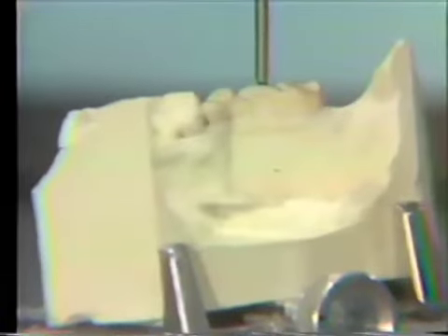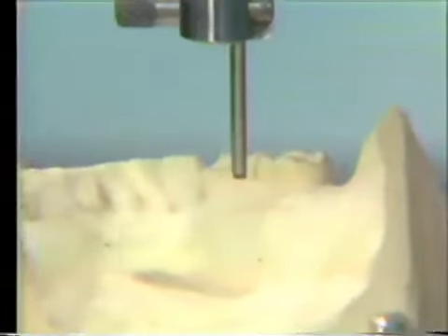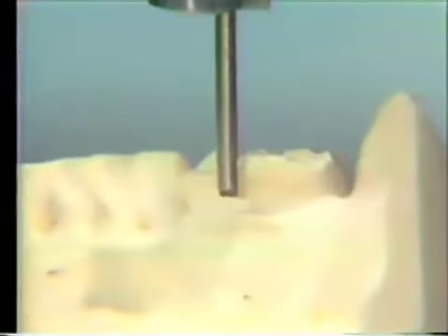Now we'll go to the opposite side, the molar abutment, and just mark the undercut on that tooth. We'll see its height of contour.